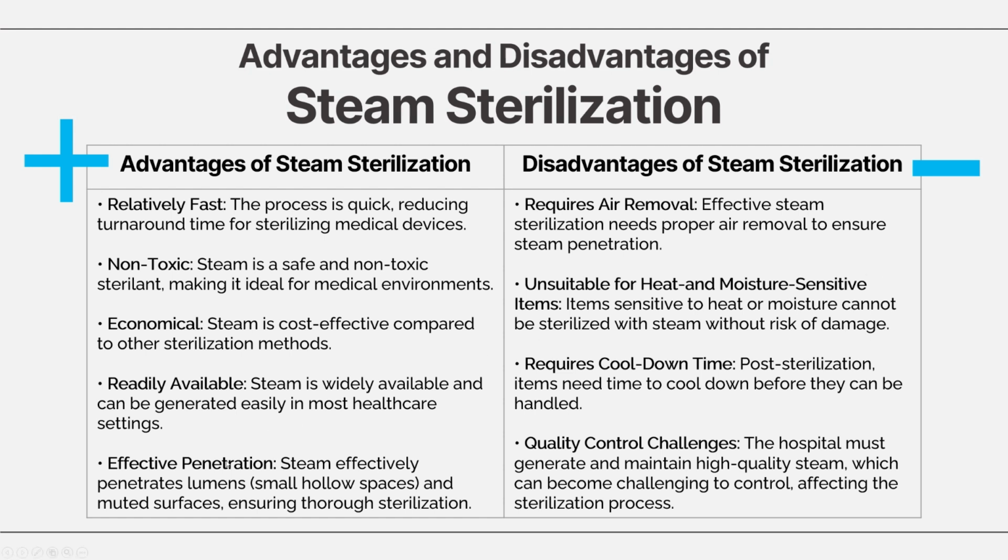And of course, effective penetration, right? Steam's moist heat efficiently transfers into lumens, porous materials, and complex instrument surfaces, ensuring microbes are destroyed even in hard to reach areas. And of course, there's also disadvantages of steam sterilization.